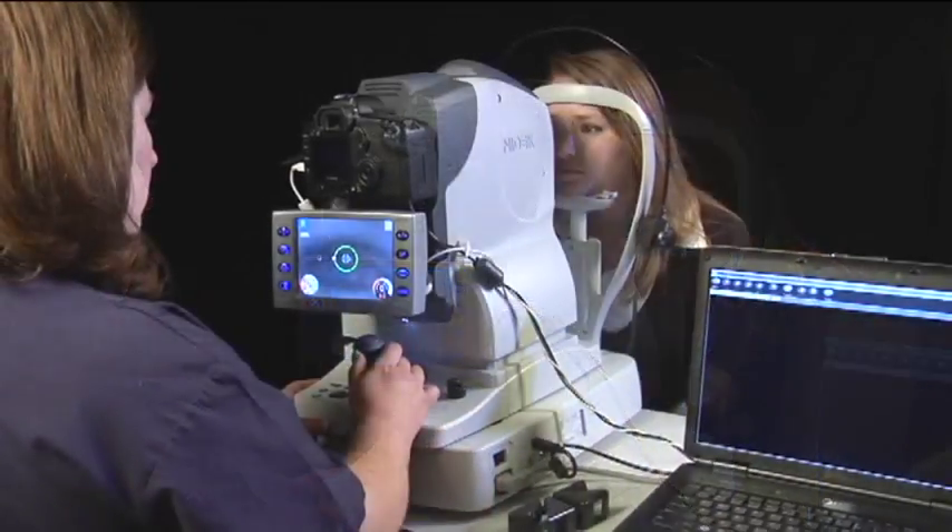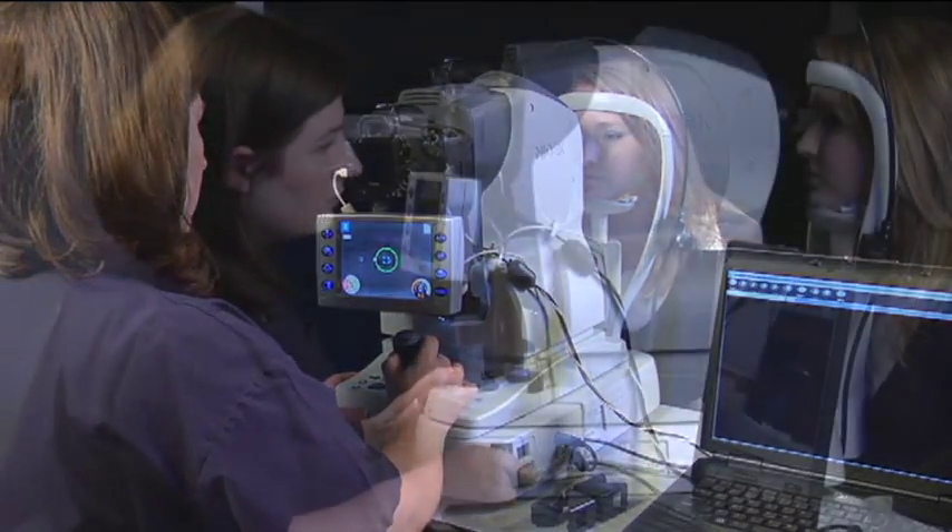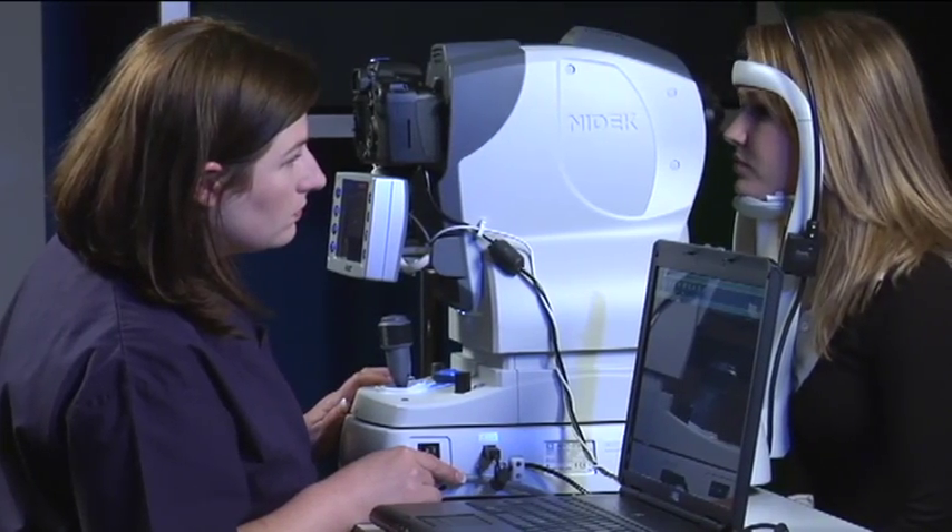When taking stereo disc photos, the patient will be situated in the same position as for taking normal retinal images. Adjust the motorized table and chin rest to fit the patient.